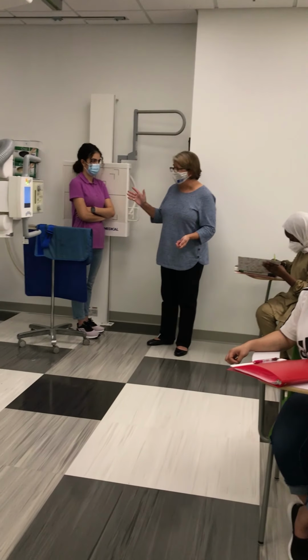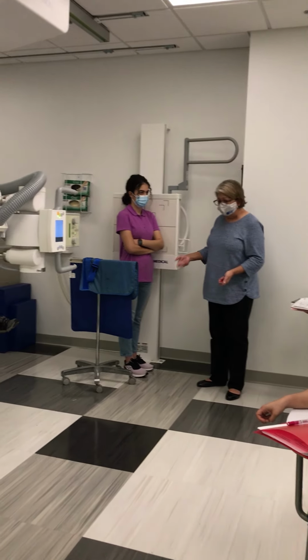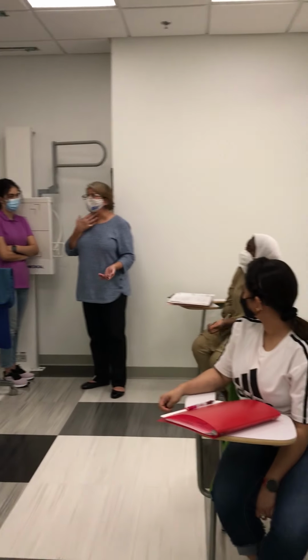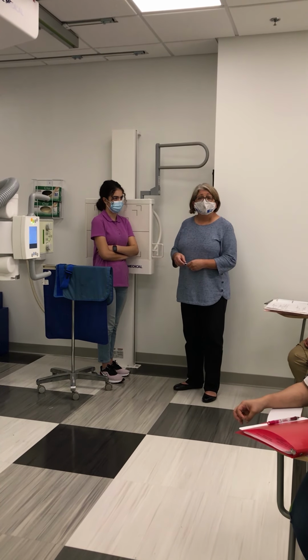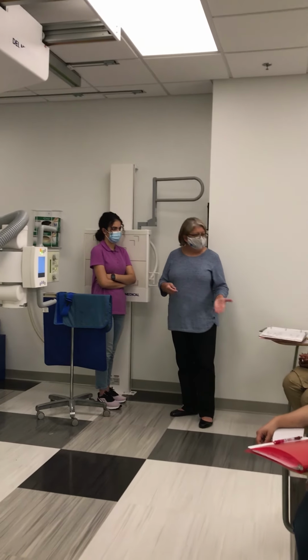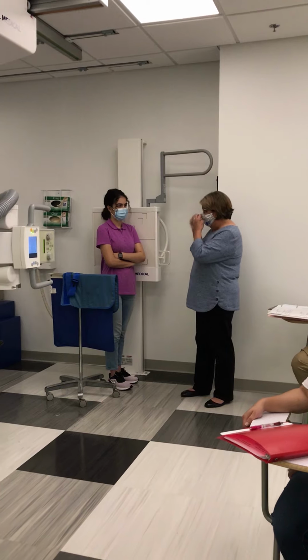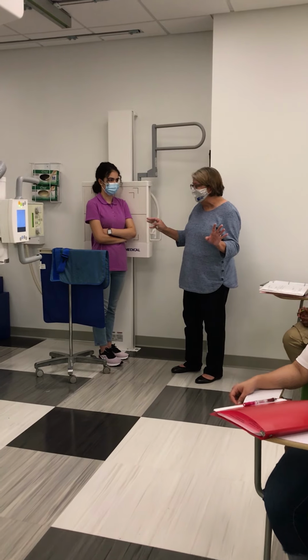And there's going to be somebody in your class, hear me now, believe me later, that's not going to tell their patient to raise their chin, but your patient will do that automatically, and I'll say, you'll need to attempt this again, and you'll say, why? Well, you didn't tell the patient to raise her chin. Well, her chin was raised. Okay, but you didn't give those instructions, so how do I know you knew to do that? See what I mean? So if you're the patient, don't help out, because you're really not helping out.